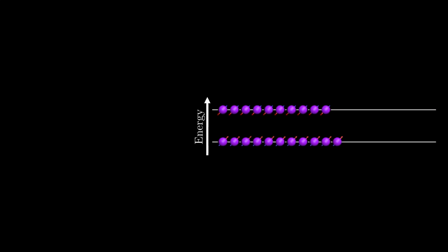Okay, this may be a good time to clarify something. On the last video, I drew this ball and arrow representation of a proton, which I think helps to conceptualize the spin magnetic moment, precession, flip angle, and relaxation phenomena. But just to clarify, individual protons can exist only in one of two Zeeman states within a magnetic field, spin up or spin down.